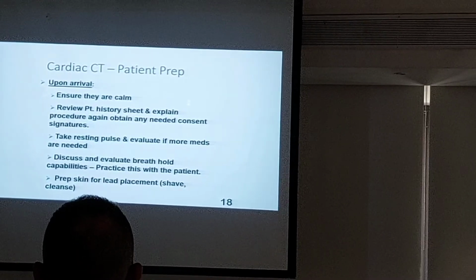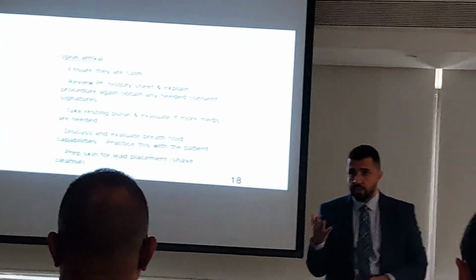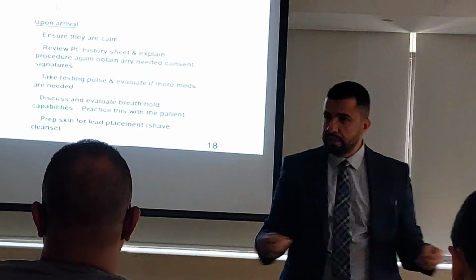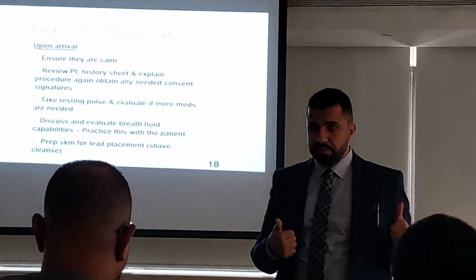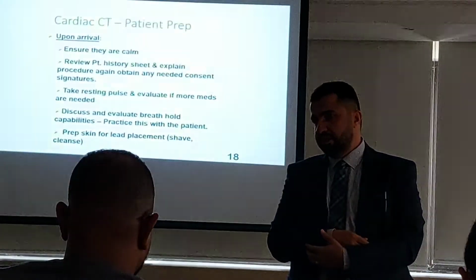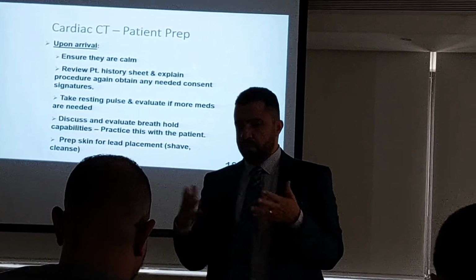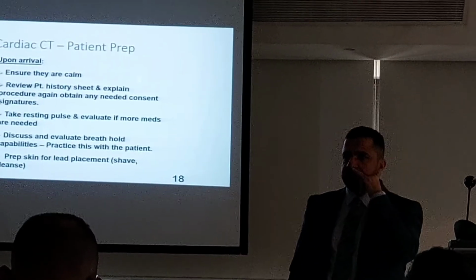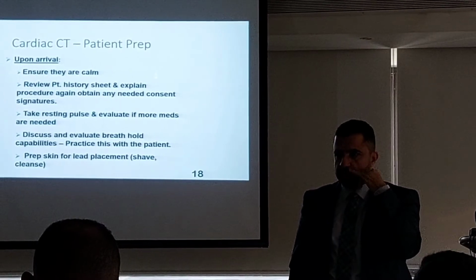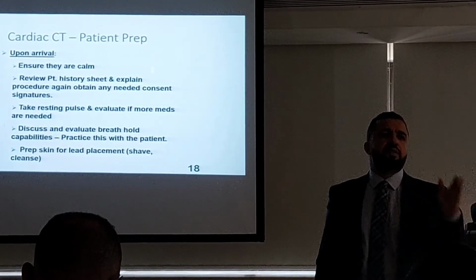Now the moment the patient is coming, the first thing you will do is take him to the recovery room, lie down, take resting heart rate and breath-hold heart rate, and check it. From that you will decide. It's your policy. I will call the doctor. Doctor, the heart rate is this. What should I do? I know what I should do, but I will not take the decision. So what should I do? You tell me, okay, take the patient.